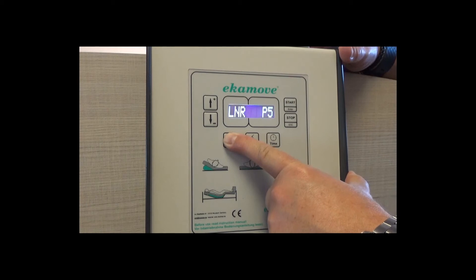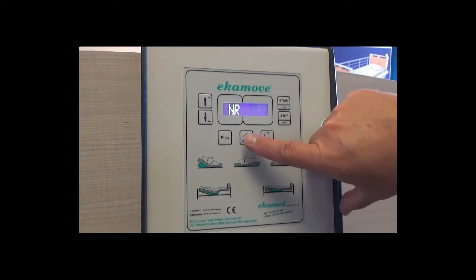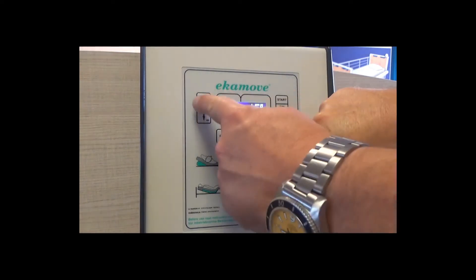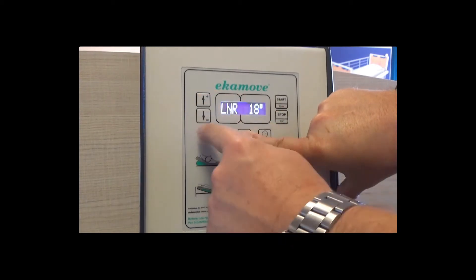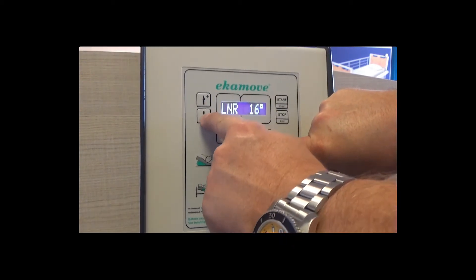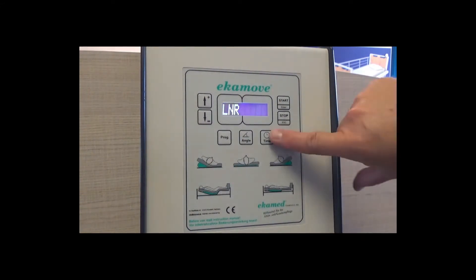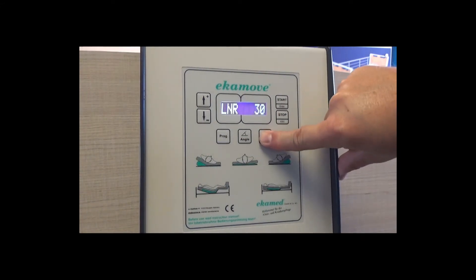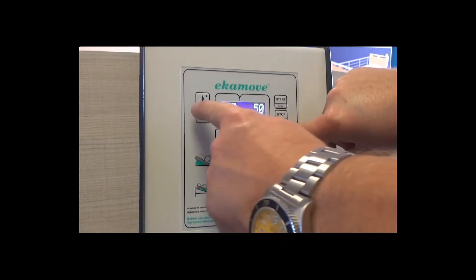Select the program you want to use. To change the angle, press and hold the angle button and use the up and down arrows to select the angle required. To change the dwell time, press and hold the time button and use the up and down arrows to select the time required.